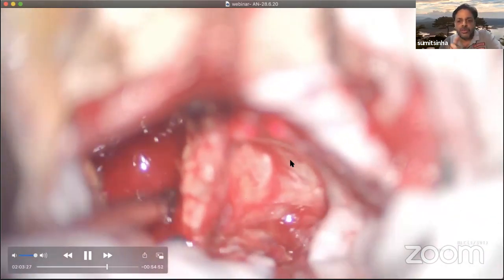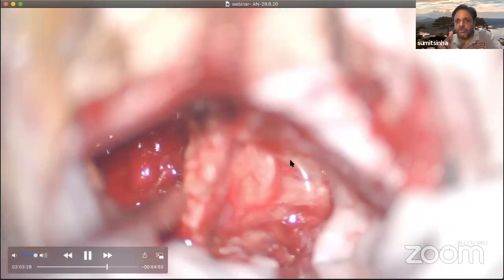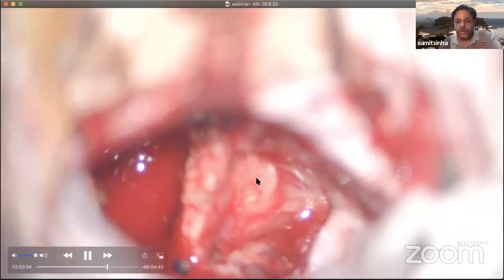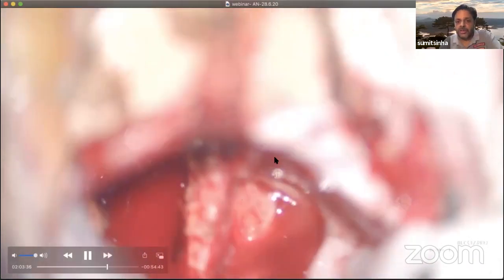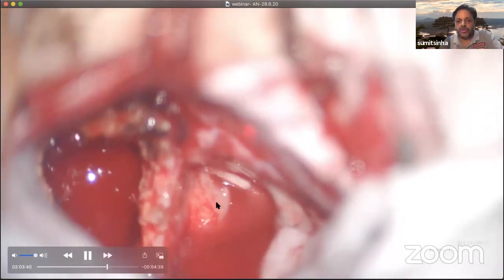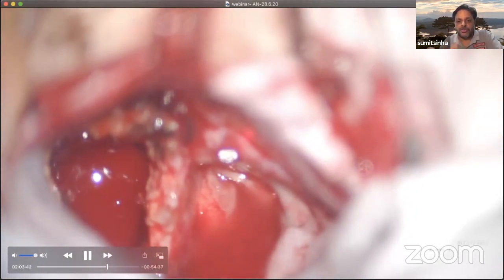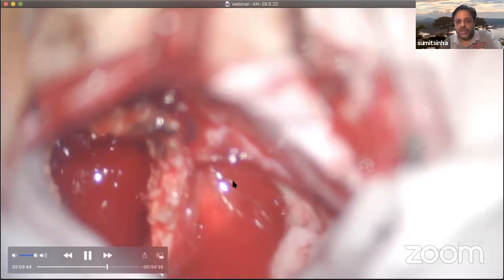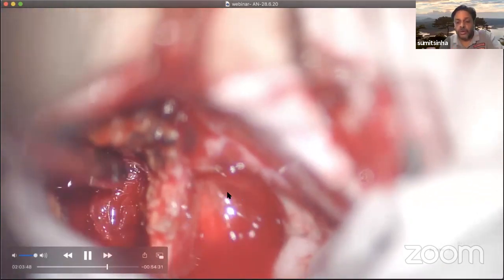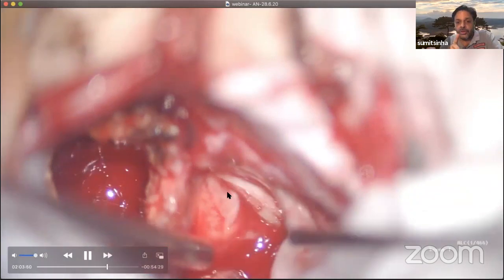The facial nerve has not to be separated from the tumor, and there is a big difference between the two things. I mean, and you saw how to get it done. This is the facial nerve, and I was just separating the tumor. Sharp dissection always. Near the facial nerve, always sharp dissection. And you see, there is no arachnoid between the facial nerve and the tumor capsule, like the one which I was saying before.